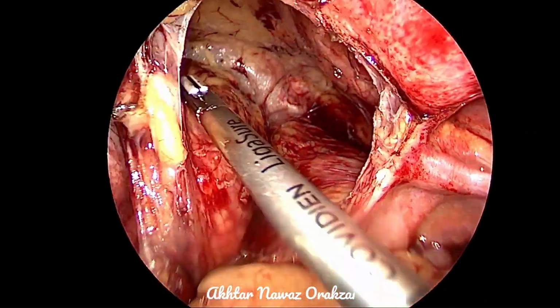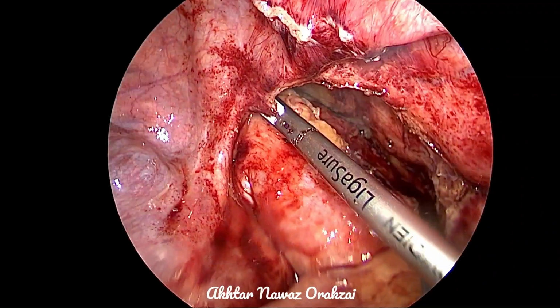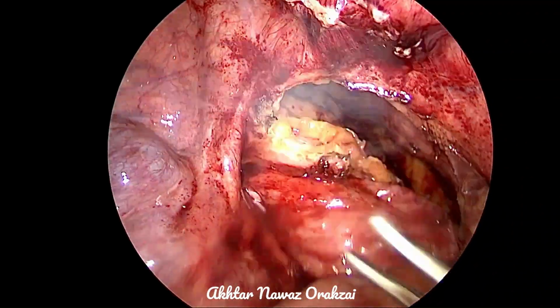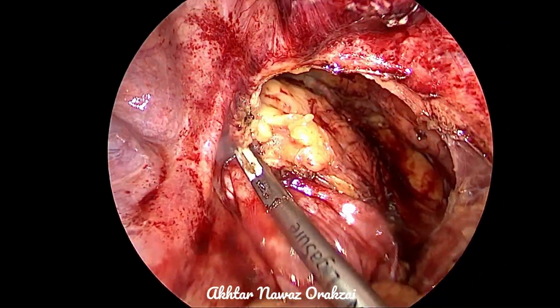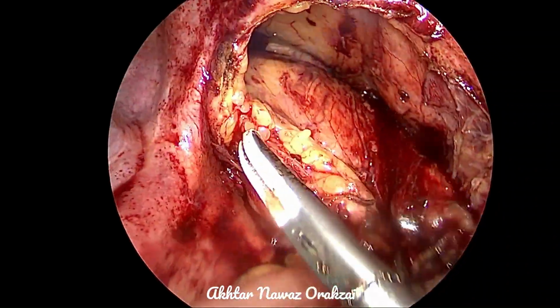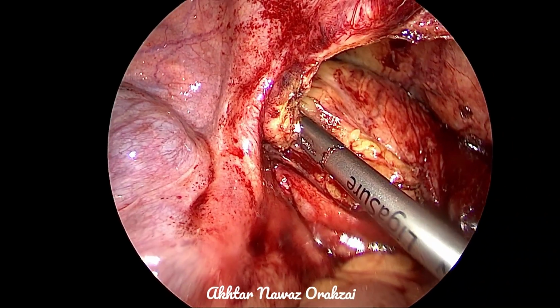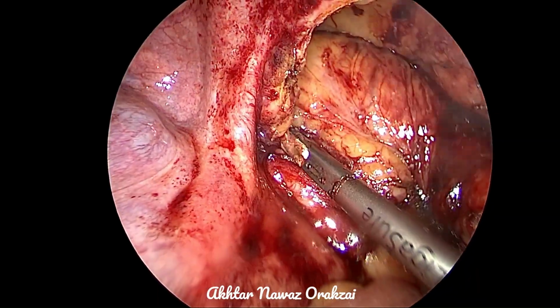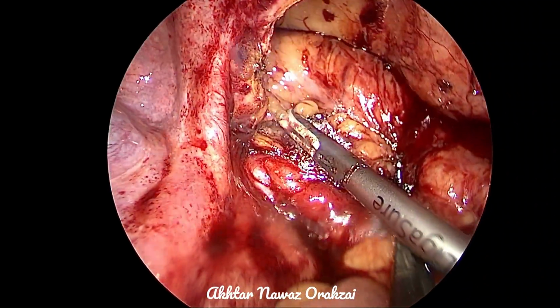not to injure the inferior epigastric vessels, although the obliterated umbilical arteries come in the way, and those can be clipped or carefully coagulated, because it is known that they are thought to be obliterated arteries. However, if they get injured and open, they can bleed significantly at times. So care must be taken.